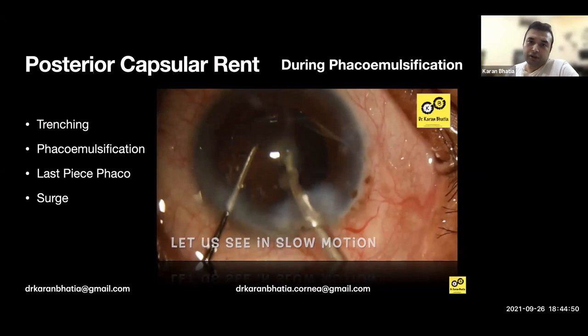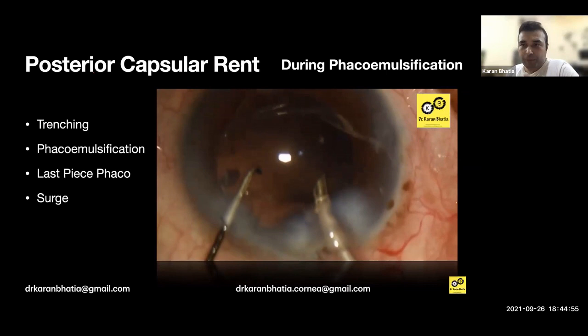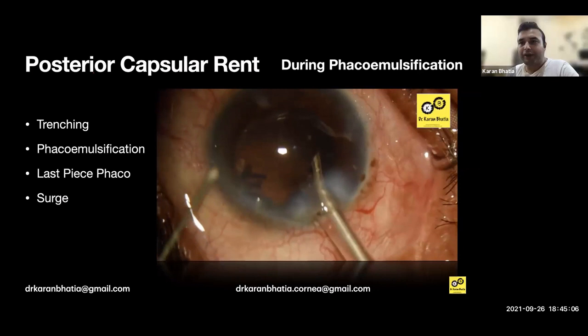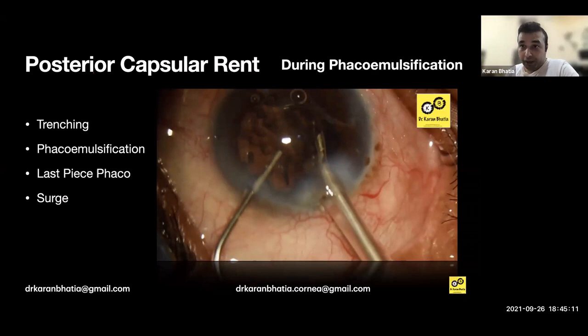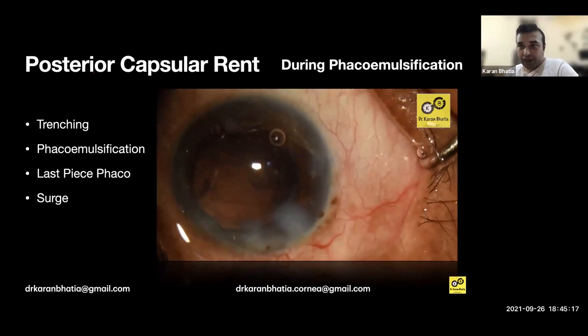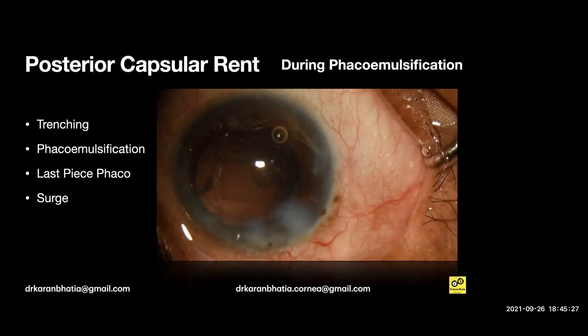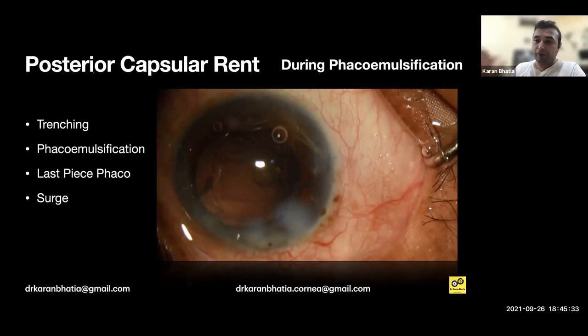As I am saying, in last-piece FACO I recommend putting OVD — VSCO or HPMC — to push the PC back and then do it. If a rent occurs: do not come out of the eye. Lower the bottle height, inject OVD from the second instrument to flatten the vitreous and push the posterior capsule back. Any OVD is fine — Viscoat is better. Push it back and keep it in position so vitreous collapse is minimized, then bring your FACO probe out. If you bring the probe out suddenly without doing this, the rent will increase.